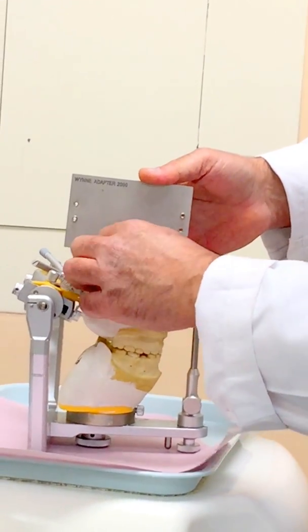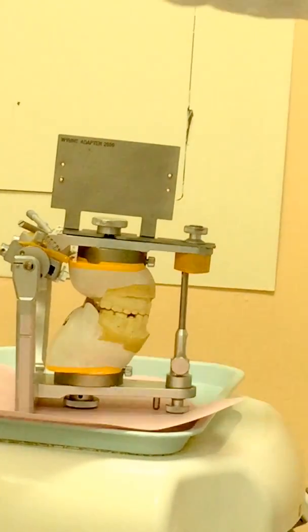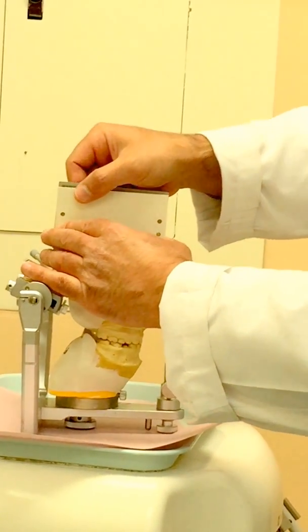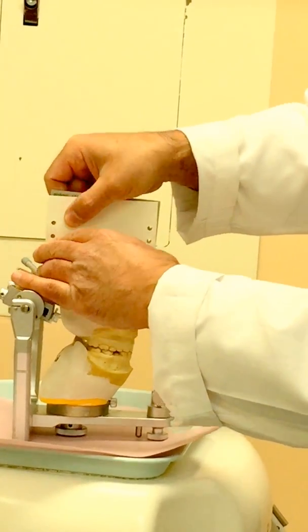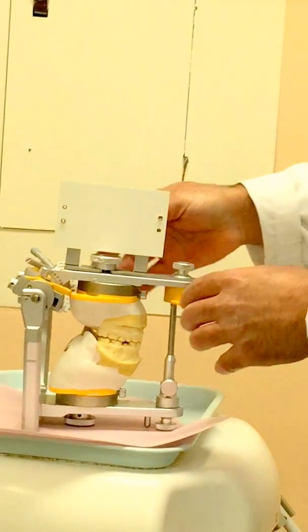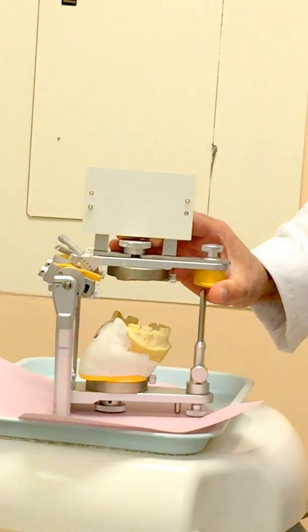The WIN adapter 2000 plate is already secured. I'm going to place a plastic record card on the adapter. I'm going to be removing the maxillary cast for better demonstration of the occlusal plane analysis.